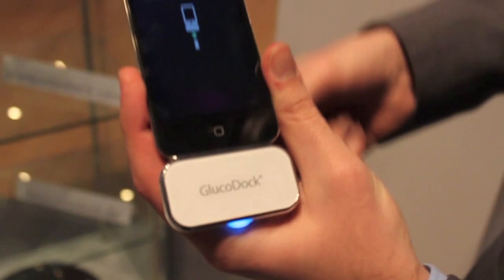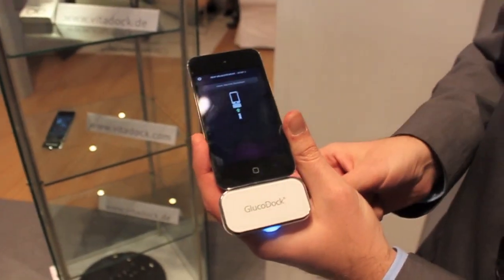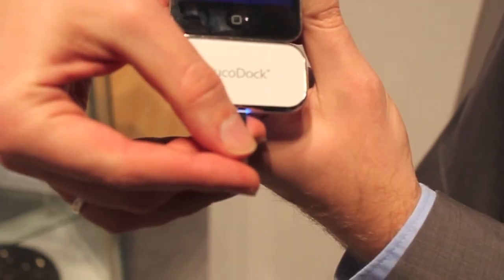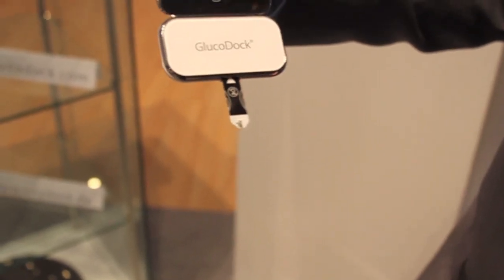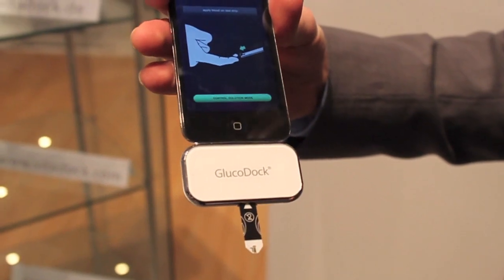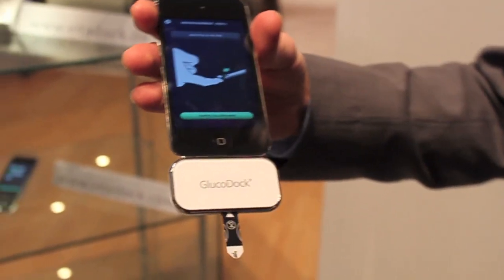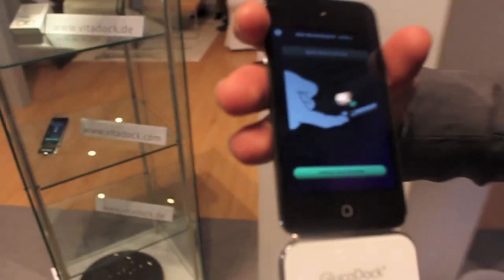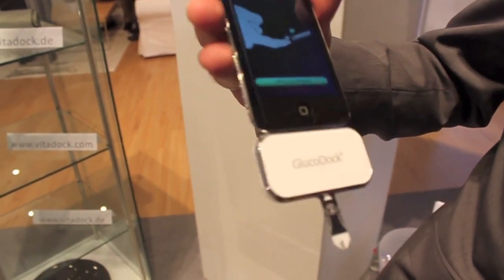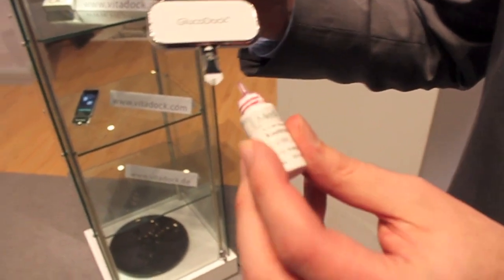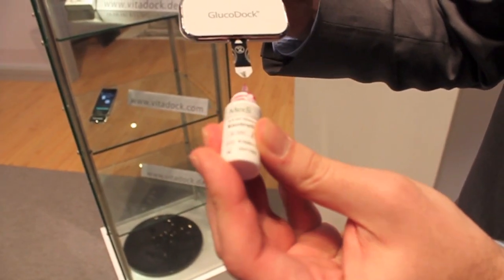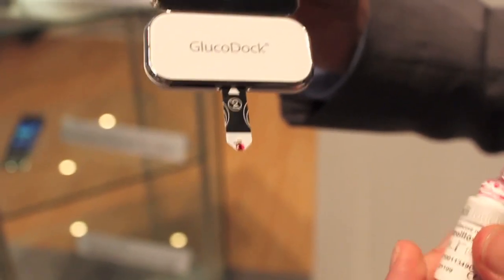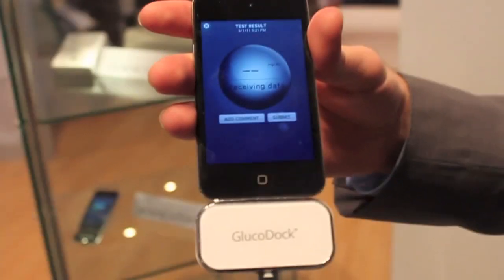It zooms in the module and asks for the test strip. After that, it shows that the user shall put a drop of blood on it, which we will do in the form of test liquid. We just need a tiny drop. And then the blood sugar reading starts.